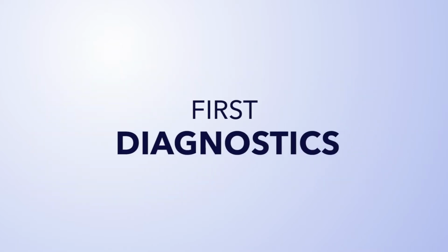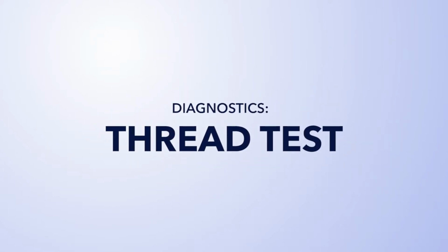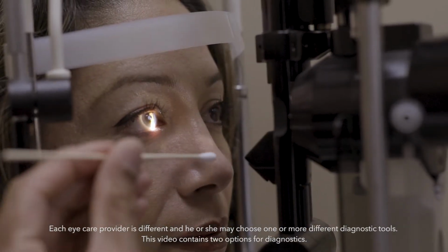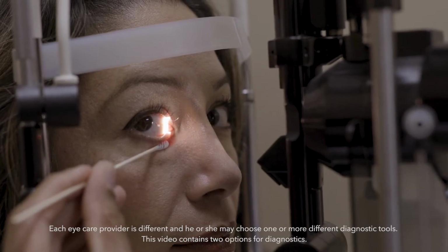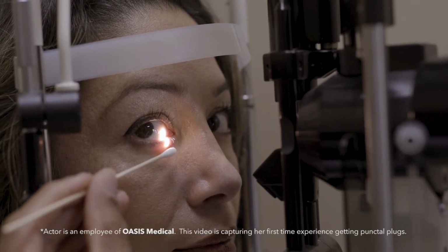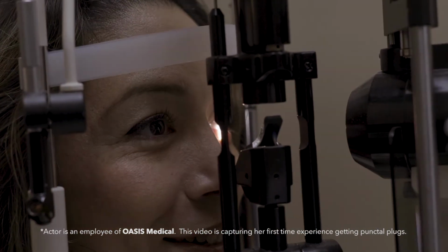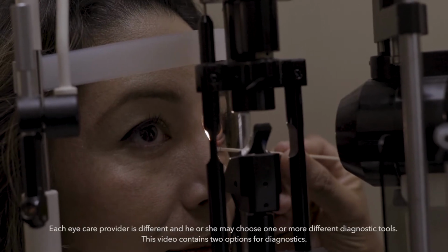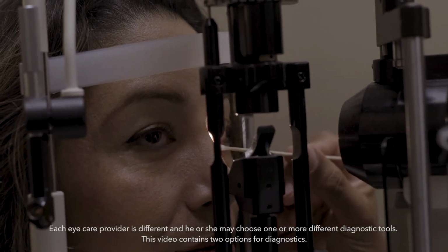First is the diagnostics. Right now, you're about to see a thread test. I looked at her eyes, and then I like to look at the puncta itself. Have you look up and to the right, invert the lid, and you can see the puncta. The reason I do that is I like to see what size. I just look and say, oh yeah, it's a small one. And you always look at both because it could be different sizes. Really? Yeah, it's not always symmetrical.